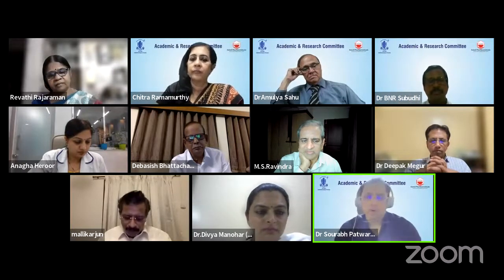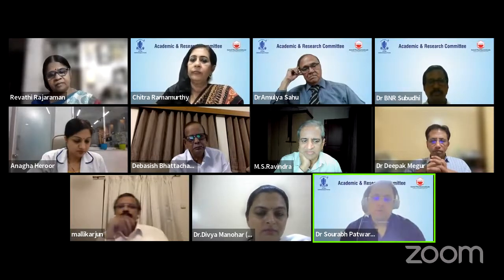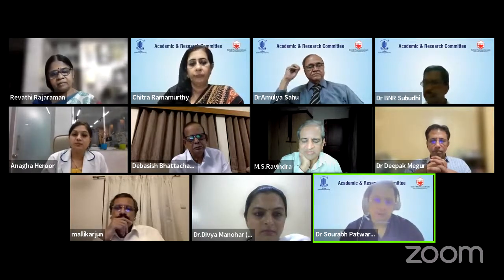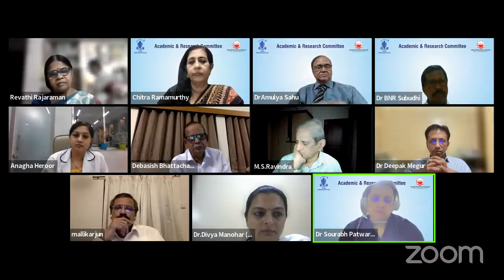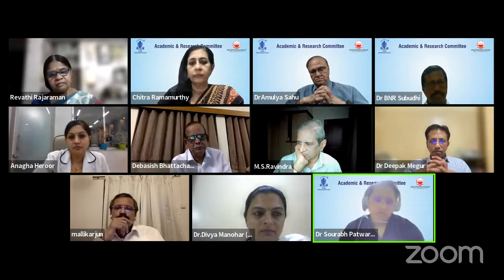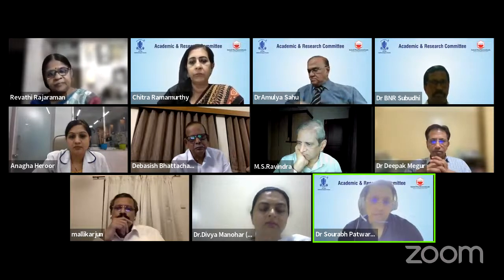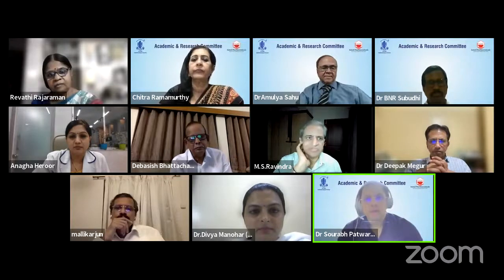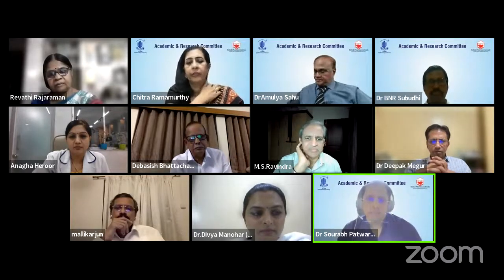They have operated for years together, so they will be in a better position to tell. Yeah. And it's very subjective, because surgeon to surgeon, skill levels are quite different. But what I have seen, whenever a superior incision is taken, there is definitely a drift over a period of time. And sometimes it is beneficial also, because this astigmatism may add to some uncorrected near vision, as is proposed. Yes. But I think that, for me at least, remains an unpredictable area of SICS.